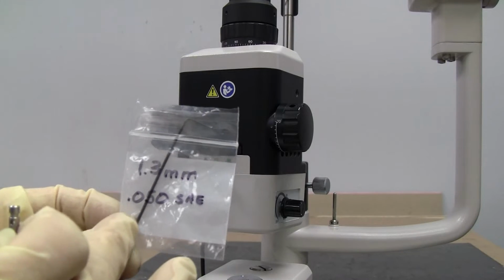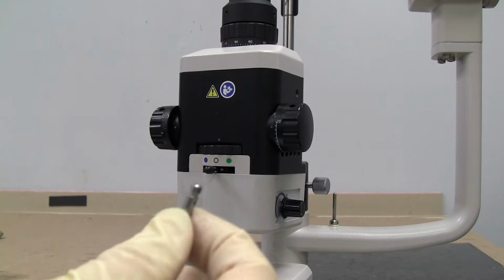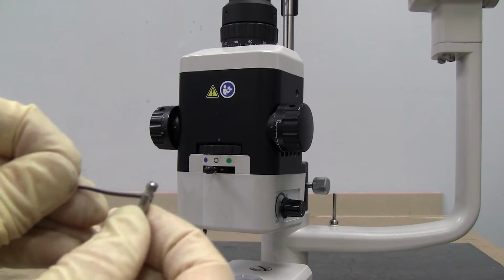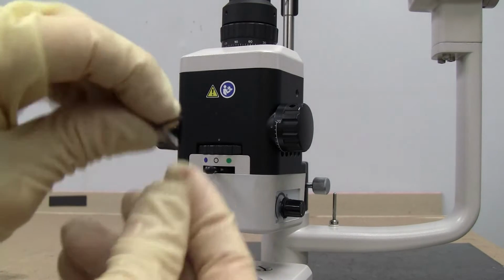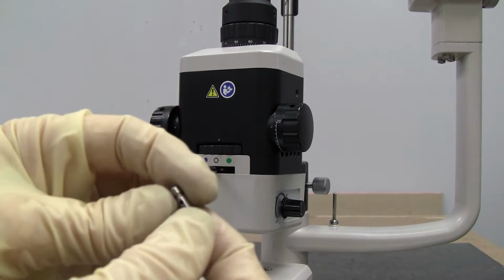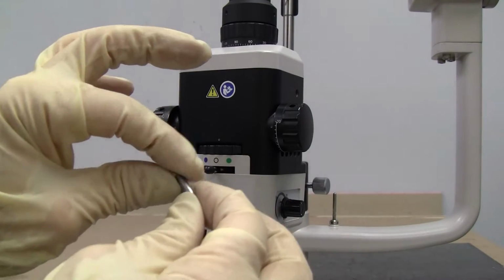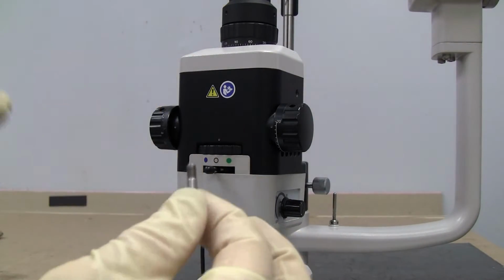mil or 0.050, it will fit in there and you can get some good leverage on it. That's what happens most of the time, is that it's just tightened by finger tight, and so it gets loose.